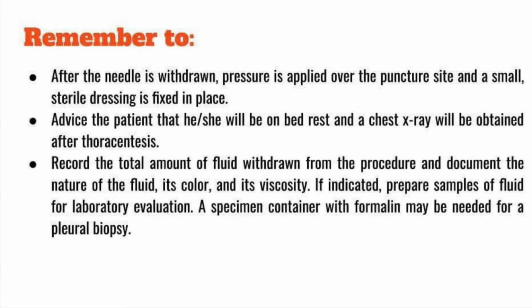After the needle is withdrawn, pressure is applied over the puncture site and a small sterile dressing is fixed in place. Advise the patient that he or she will be on bed rest and a chest x-ray will be obtained after thoracentesis. Record the total amount of fluid withdrawn from the procedure and document the nature of the fluid, its color, and its viscosity. If indicated, prepare samples of fluid for laboratory evaluation. A specimen container with formalin may be needed for a pleural biopsy.